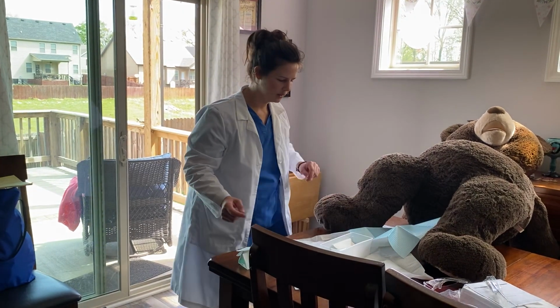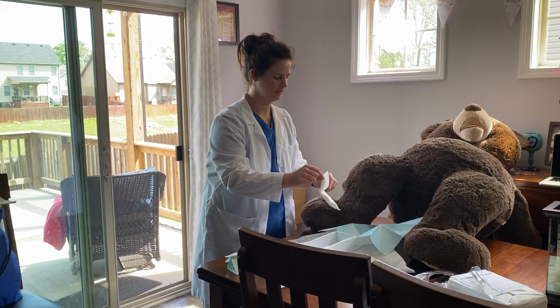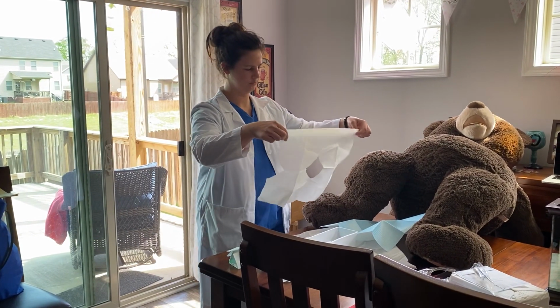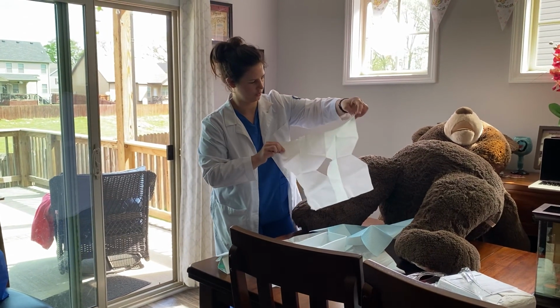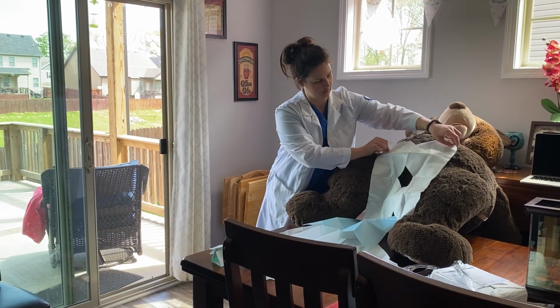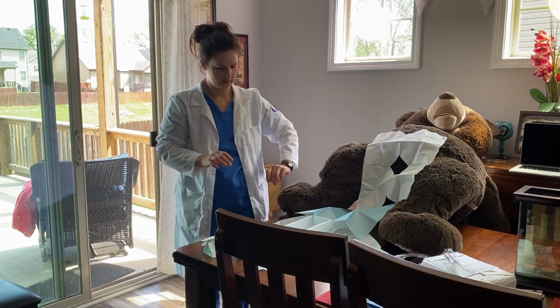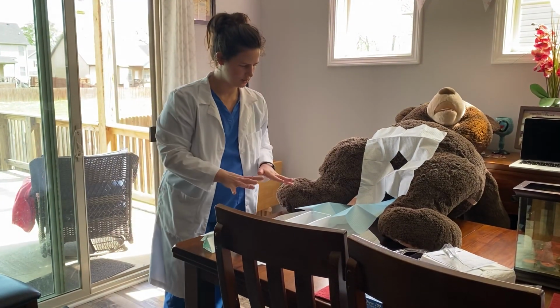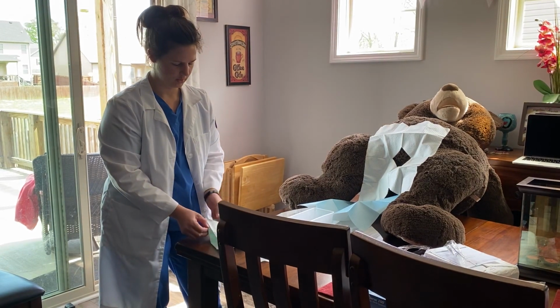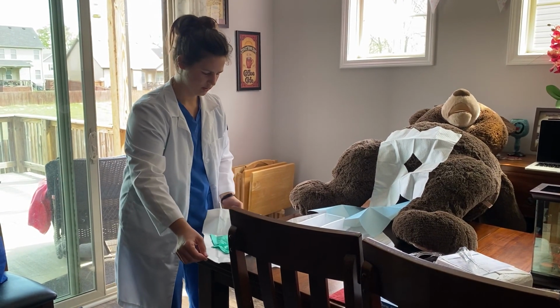Okay. And then the last thing that we're going to pull out before we put on our sterile gloves is the fenestrated drape, which the fenestrated part is just going to go right over. If you had a male part there, the penis would stick out and kind of gives you extra sterile field. Now everything else is sterile. This whole field is all sterile, so we are going to make sure that we don't cross over it. We're going to put on our sterile gloves now and start with the catheterization. We're going to be collecting a urine specimen with this in and out cath.